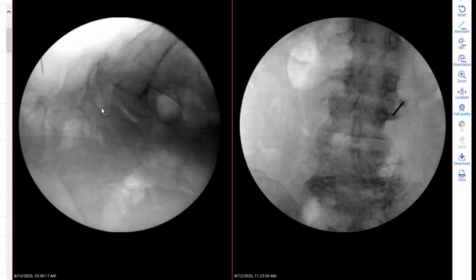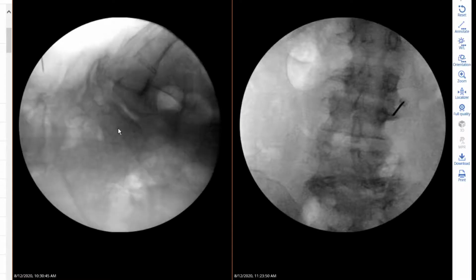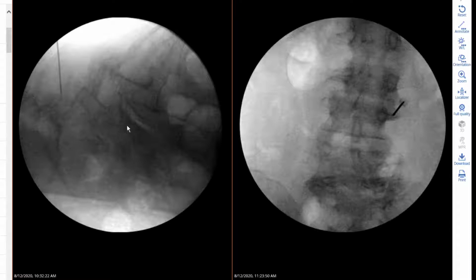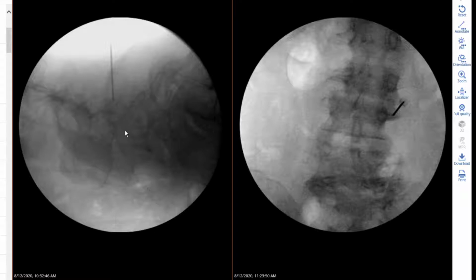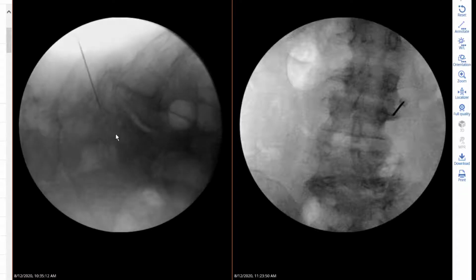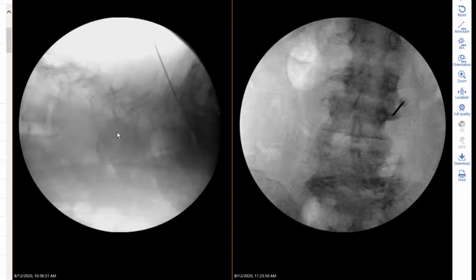To get a better picture, as you see, you have the double shadow. I'm trying to find out how much torsion there is, and I'm going to go through a significant number of pictures to evaluate that. And here you see that the double shadow is almost gone. Now I'm looking at the other levels to see the proper positioning of the C-arm. With the double C-arm technique, the setting is extremely important, so that when you are moving these C-arms, they are not in each other's way and don't prevent good imaging.